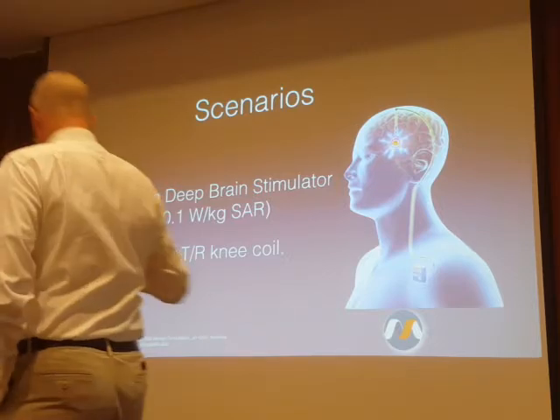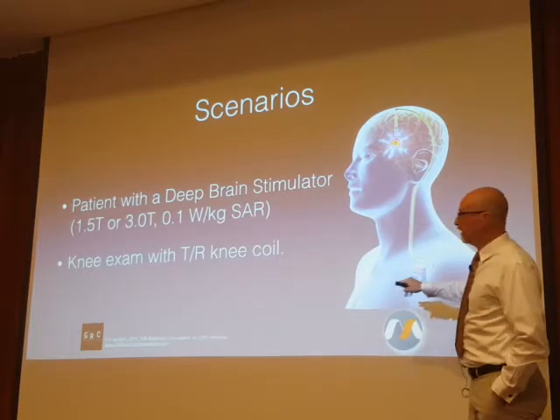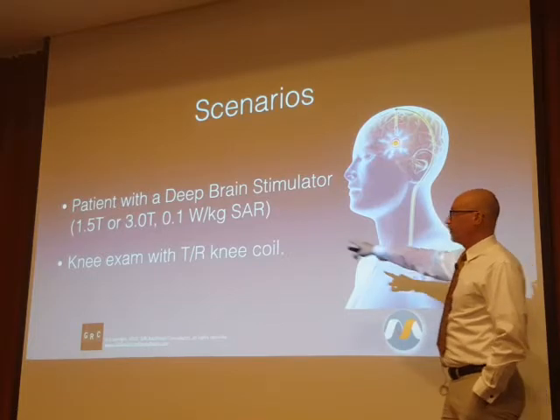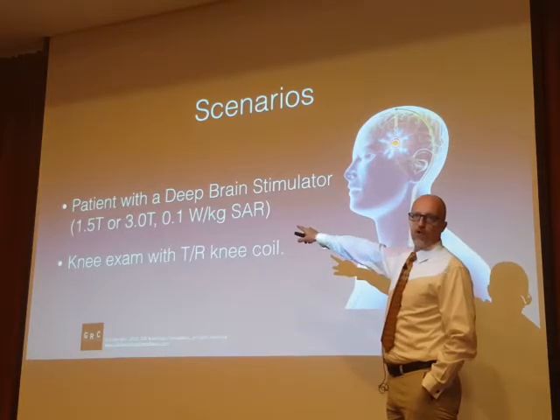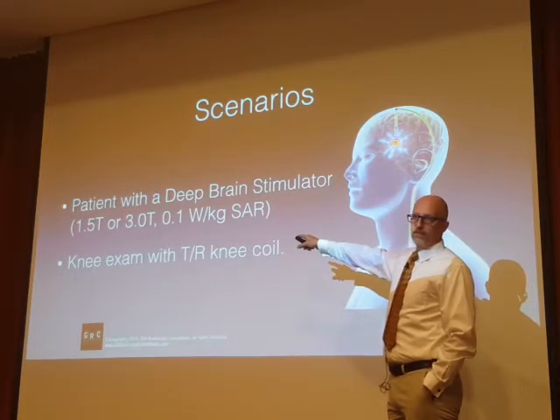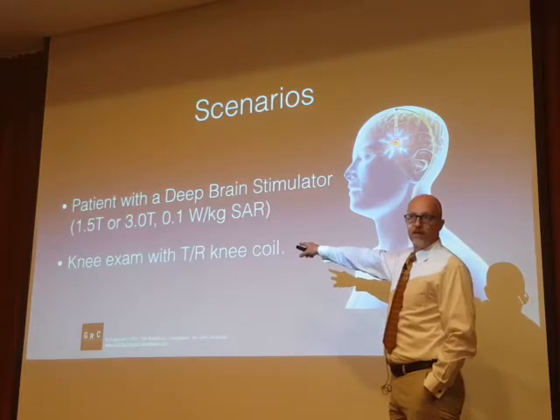Because I am quite confident that if we do a TR knee coil, the exposure at the implant is going to be well below 0.1 watts per kilogram. It's going to be so small, theoretically we could measure it, but I am 100% confident that it's going to be below 0.1.